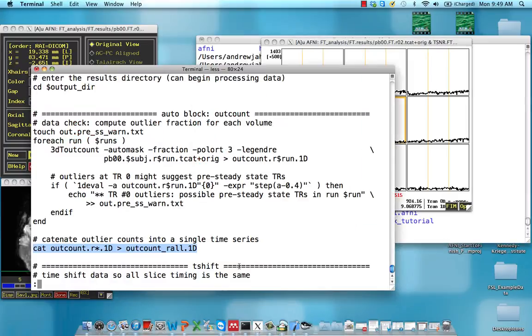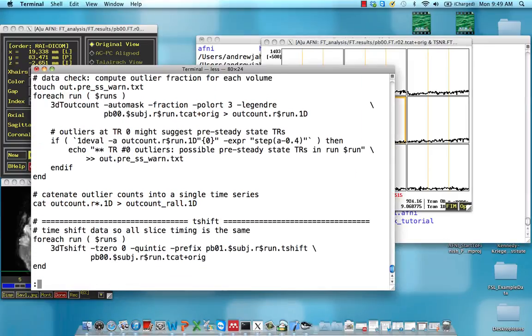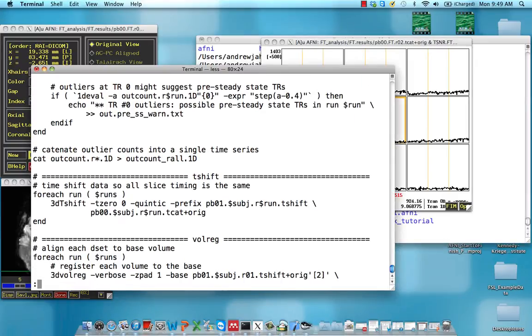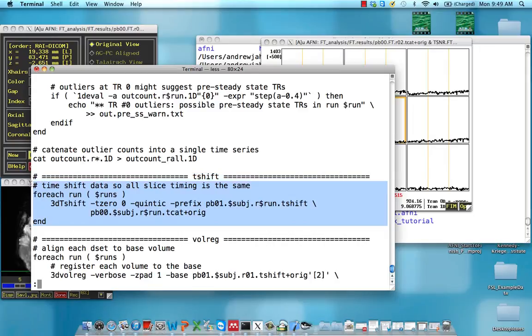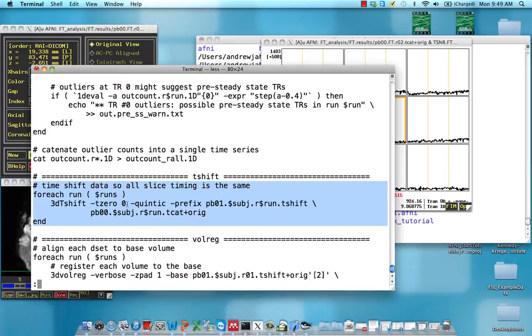If we look in our script here, this is the whole t-shift block. It's not very long, but what we have here is this 3D t-shift command, and it loops this over all the runs in our dataset. What this t-zero option means is to interpolate all the slices as though they were all acquired at the beginning of each TR.